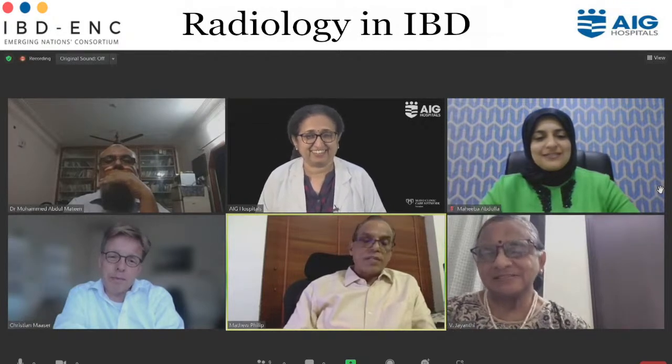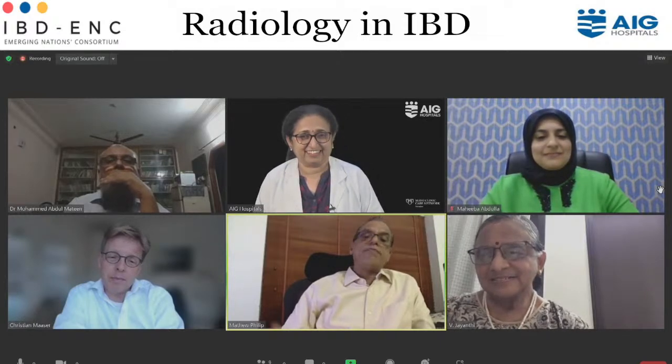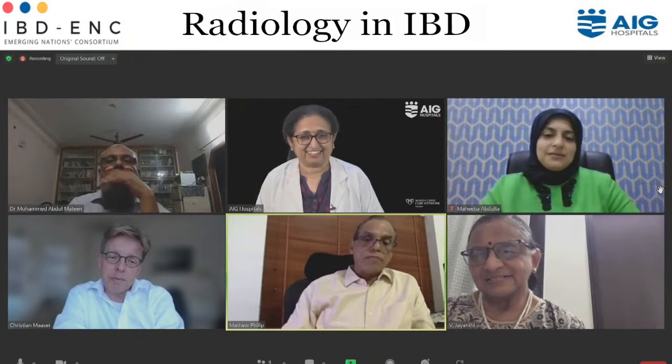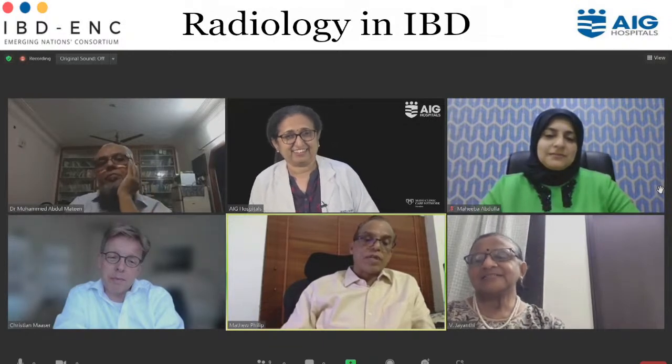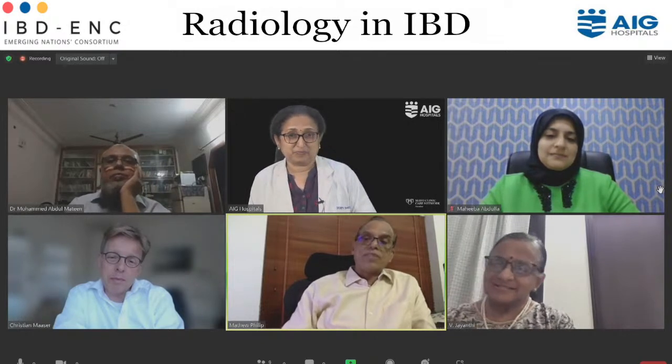For example, in colonic polyp adenoma detection rate, artificial intelligence can definitely help us in characterization of polyps, especially when we do endocytoscopy, endobrain. This all will help us. Artificial intelligence has really helped us.